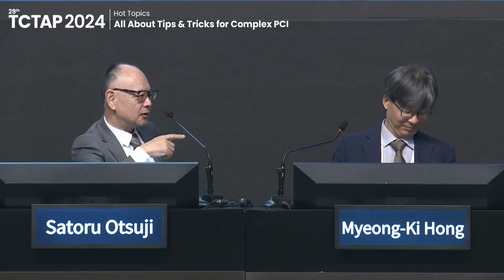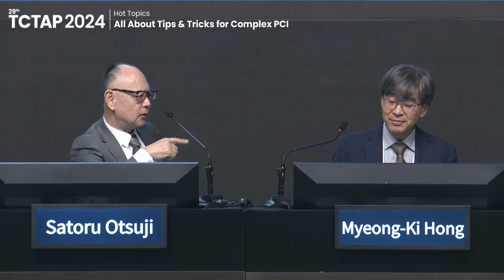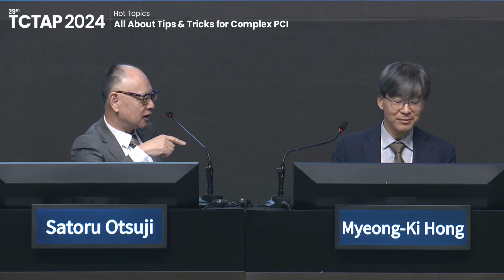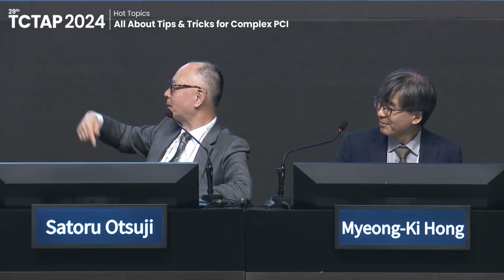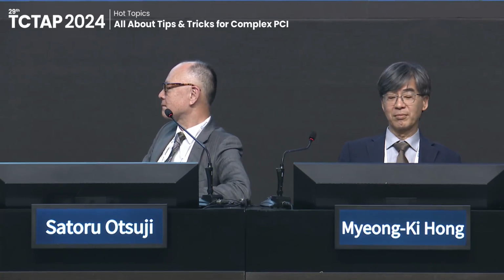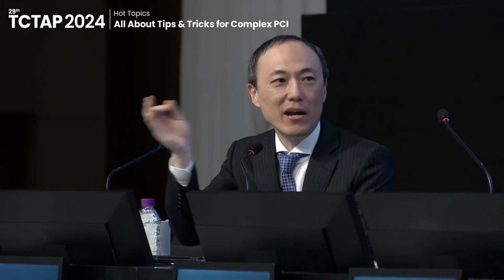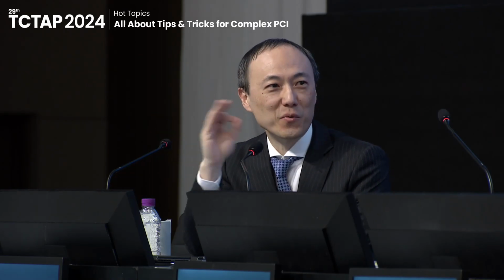Is OA, orbital atherectomy, available in Korea? Unavailable yet. Michael, how do you think OA's guidewire bias is better than rotational atherectomy for the inner curvature? So that's one of the advantages of orbital atherectomy. With rotational atherectomy, what I've seen and what I believe is that once the burr passes, no matter how many times you go back and forth, you will continue to go down that path of least resistance. So you could do 20 runs, but you're not going to cause too much modification of the plaque.